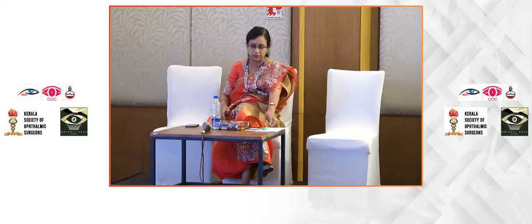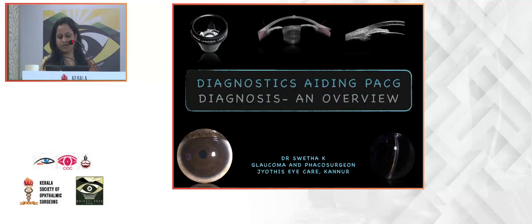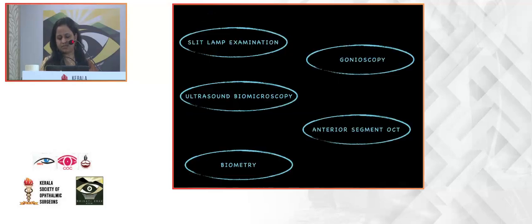I'll straight away go into my topic, that is diagnostics aiding PACG diagnosis, an overview. The most important ones we have are slit lamp examination, gonioscopy, ultrasound biomicroscopy, anterior segment OCT, and biometry.